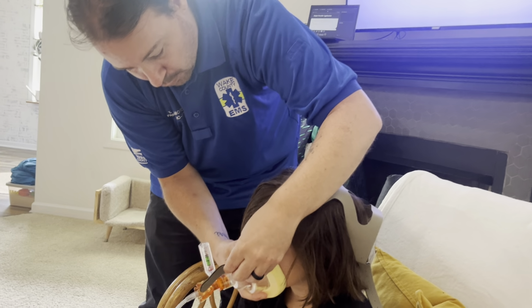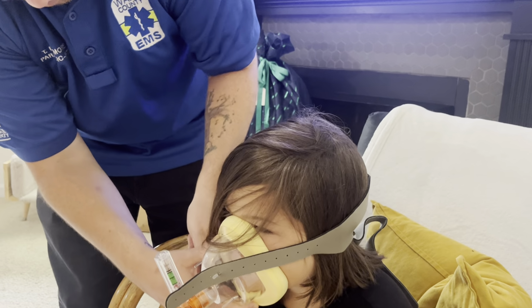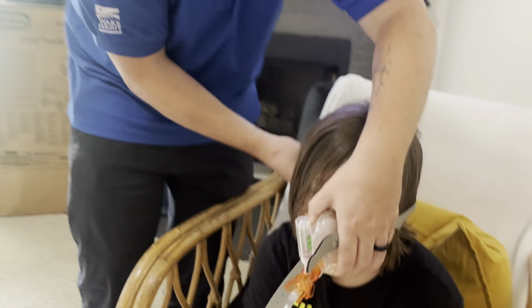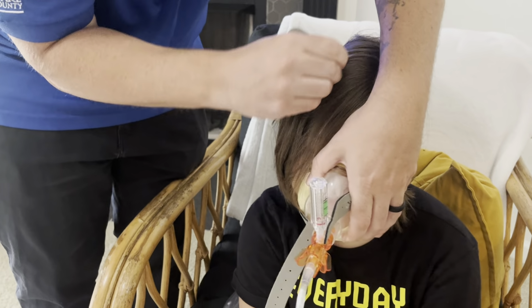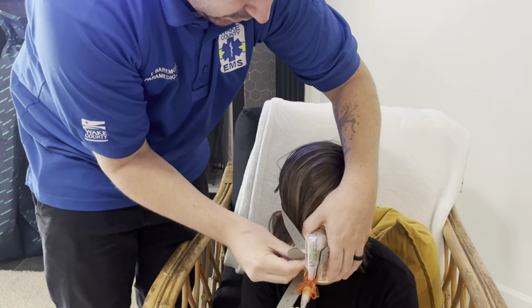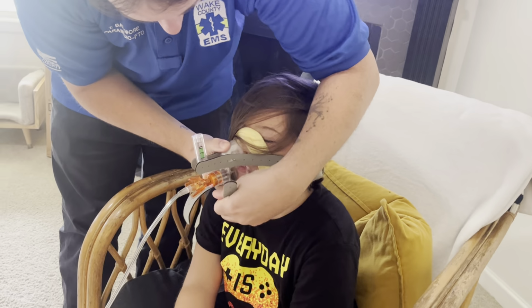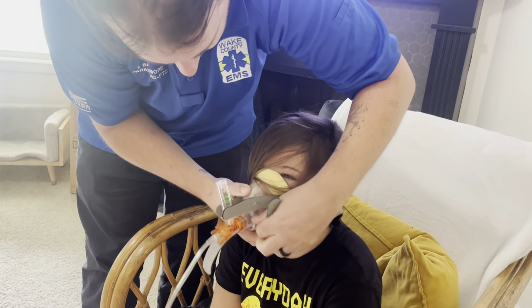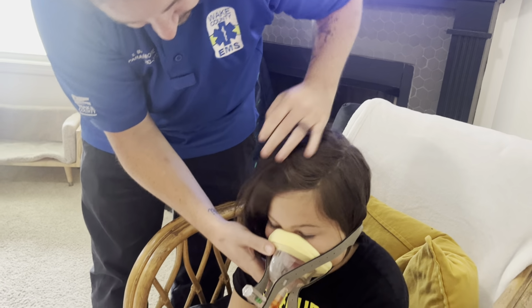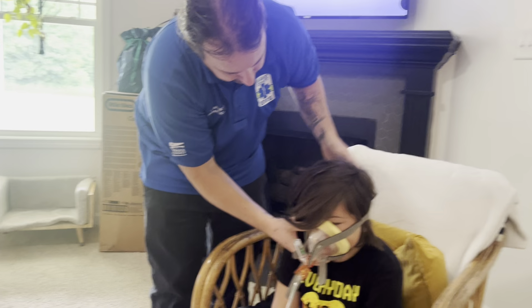Okay? So don't be afraid to just put the straps on and realize we're gonna adjust it later, right? We will make it work to the best of our ability. So we put it on. To the best of our ability here. I know it's tight, I'm sorry, bud. That's fine. All right, so then now once we got it on, I can see this is pulling down a little bit, so I'm gonna pull the headpiece up, make it sit a little prettier on him.